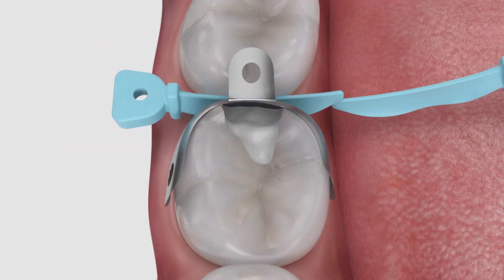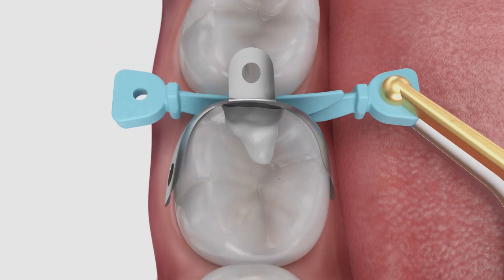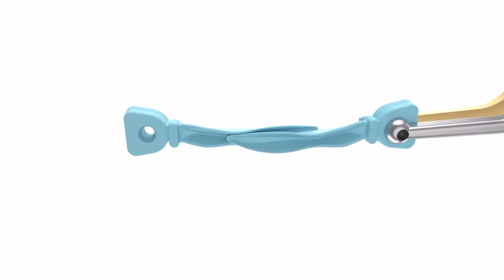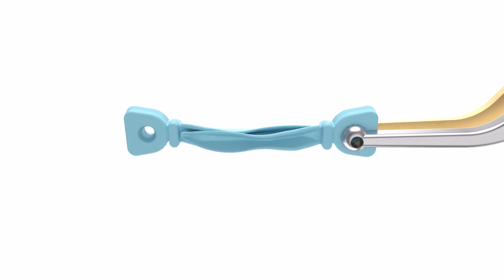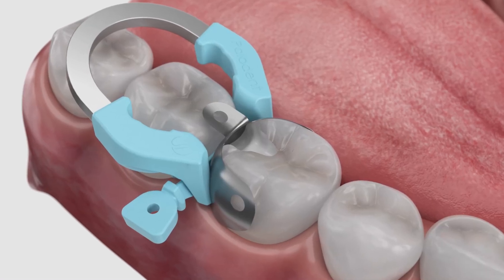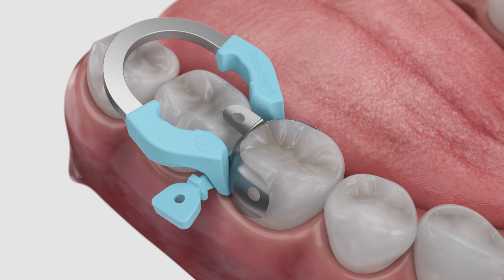If needed, a second wedge may be placed from the opposite side without removing the ring, due to the accommodating shape of the tines which allow the wedge to be placed after the ring. Now you're ready to place the restorative materials according to the manufacturer's instructions for use.